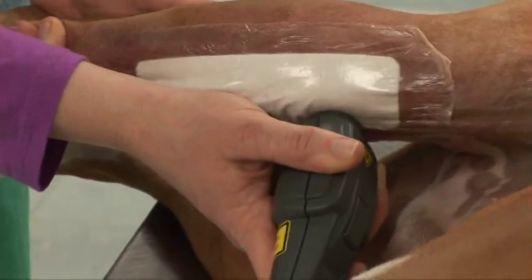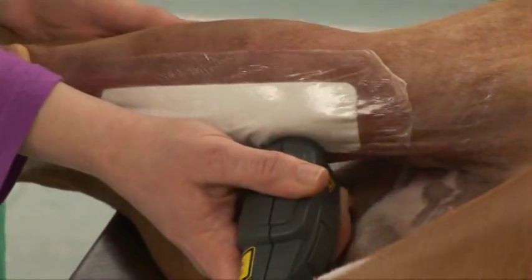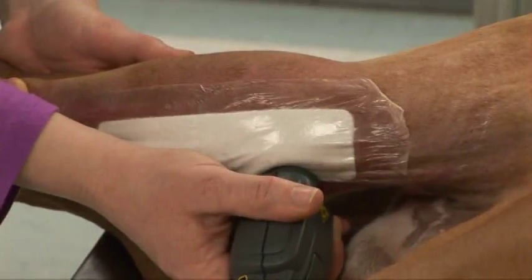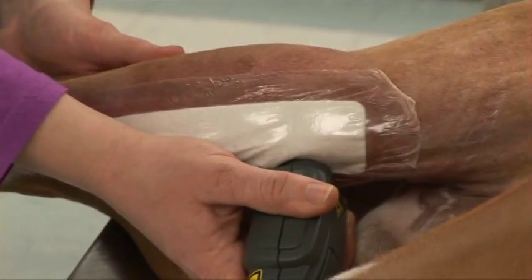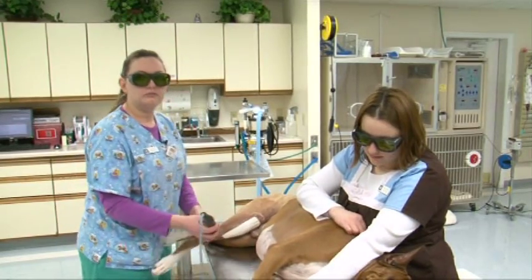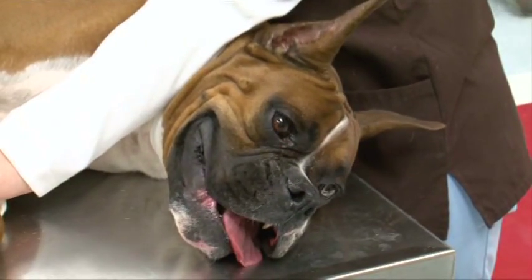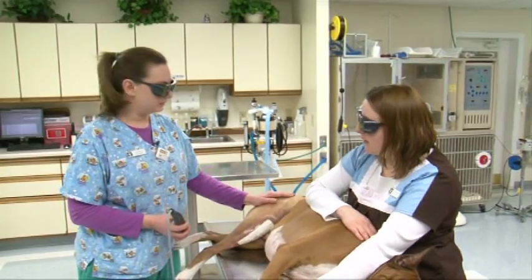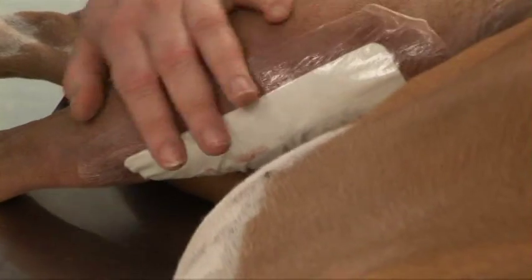When that's finished, you set up a time — usually they have six treatments that they have to go through. The second time they come in they'll have the scanning treatment, and hopefully by then they will be having some sort of ease in their pain. Levi should be walking on using both of his back legs by the end of this week and he'll come back in two weeks for his recheck.